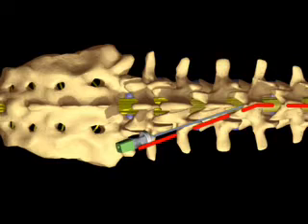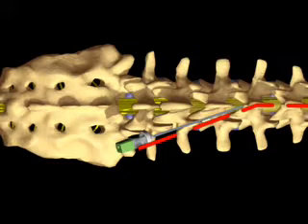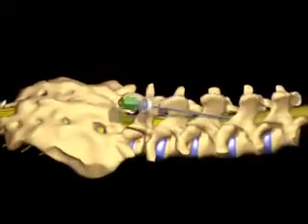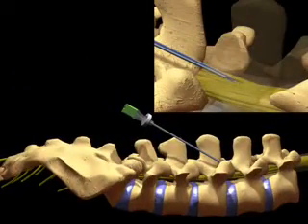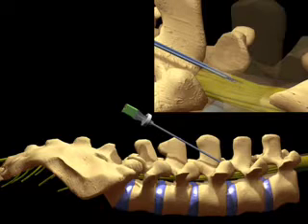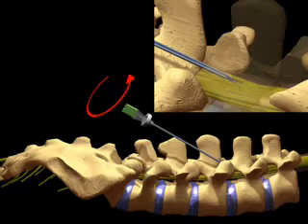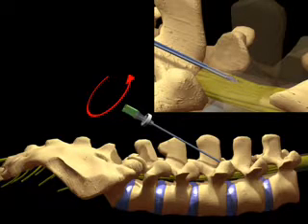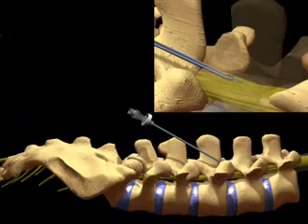The imaging target for the needle tip is the midline of the selected interlaminar space. The needle stylet should be kept in place during dural puncture with the beveled needle tip oriented parallel to the longitudinal dural fibers. A return of cerebrospinal fluid through the needle, even with the stylet in place, signals entry into the intrathecal space.